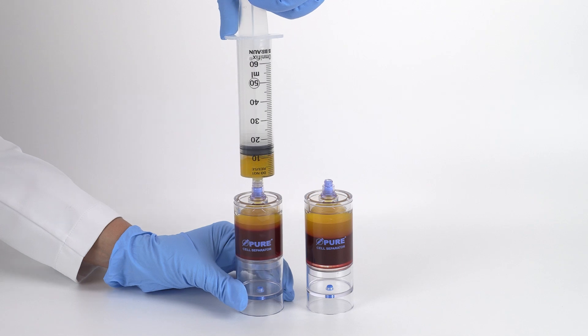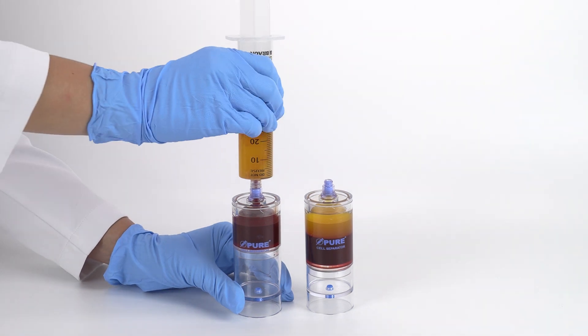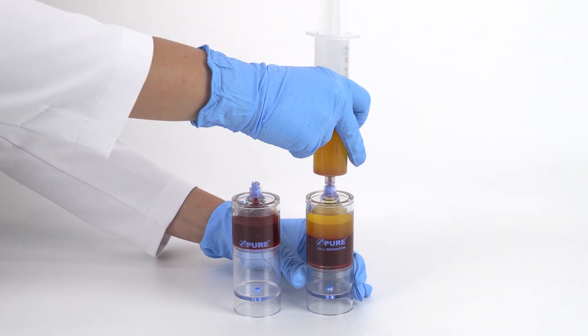Attach a sterile syringe to the top port of each device and aspirate the platelet plasma suspension. You may need to repeat this process until all of the PPS is collected.